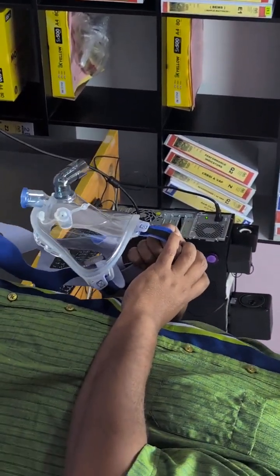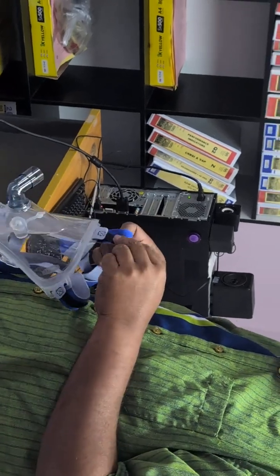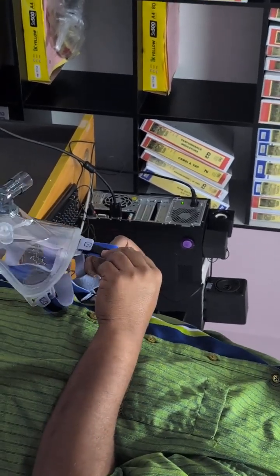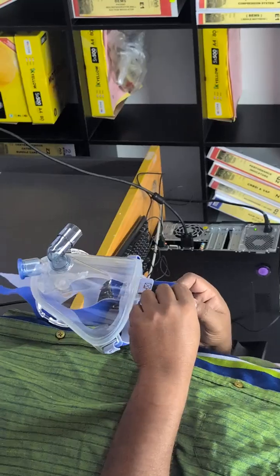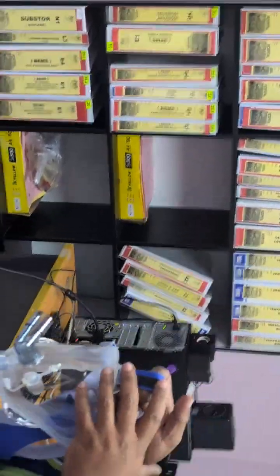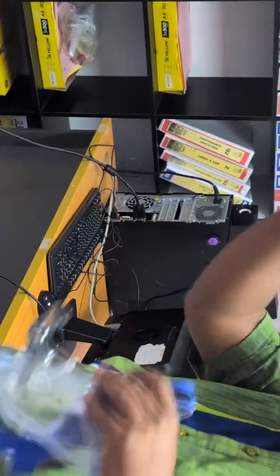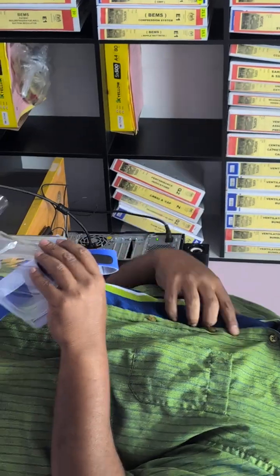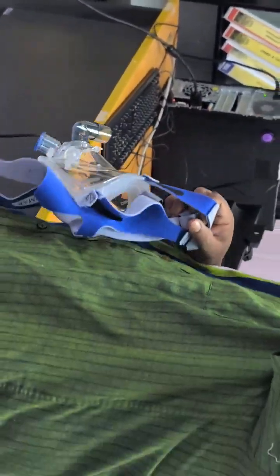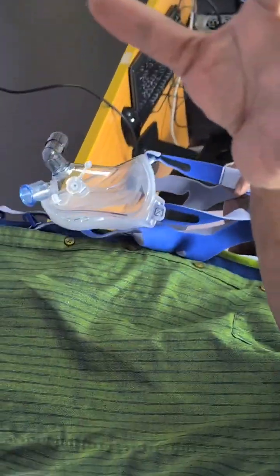The disadvantage is, no, it's not really soft, it's hard. But the velcro, after you use it 5, 6, 7, 8, 9 times, that is the only disadvantage which we have, which I'm trying to get the manufacturers to change, same as the mask earlier, to use plastic. But they gave me a very good answer. How long are you going to put the CPAP on? Because that is meant for pre-hospital and, you know, at a later stage of weaning off, right?